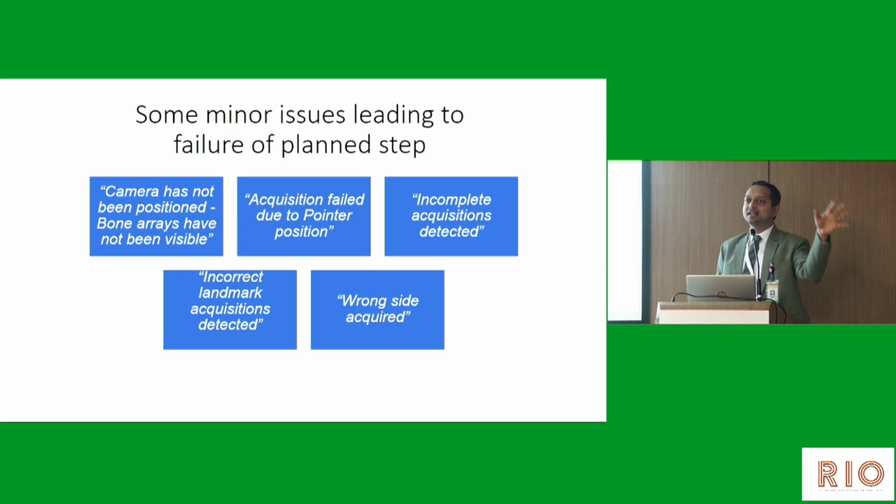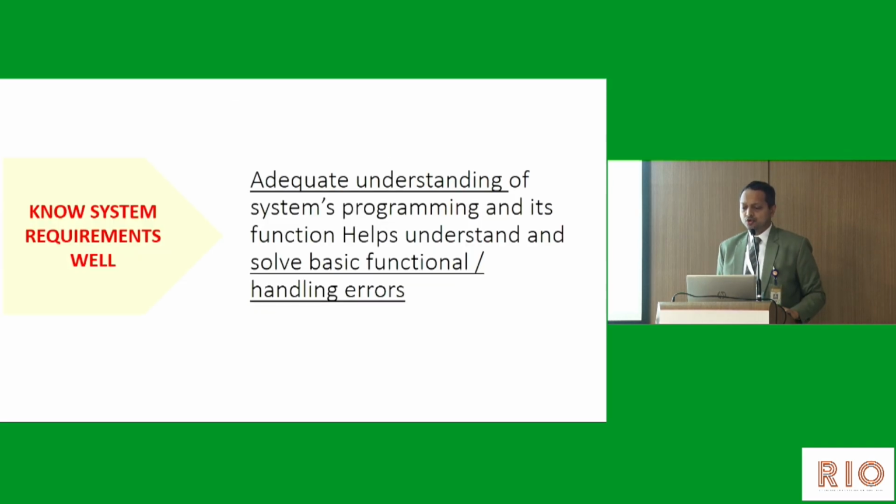All these things come with your individual experience, that in one case you face this problem, in another case you face another problem, and you might just say to the company person, oh, this is not working fine. But the fact remains that we need to be more diligent in our registration, in the assembly of the instruments, and that's what will help avoid these small errors. So know your systems well. There has to be adequate understanding of the system's program.